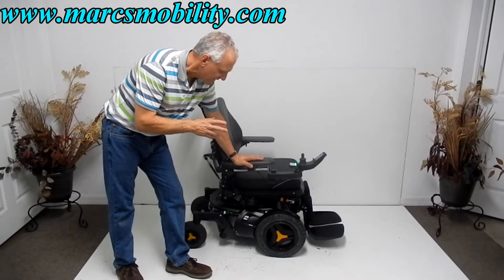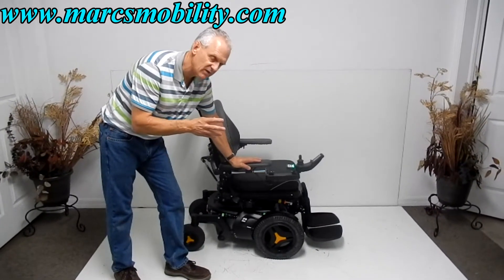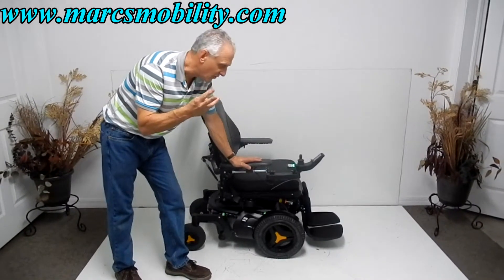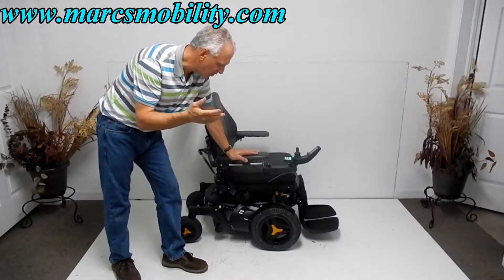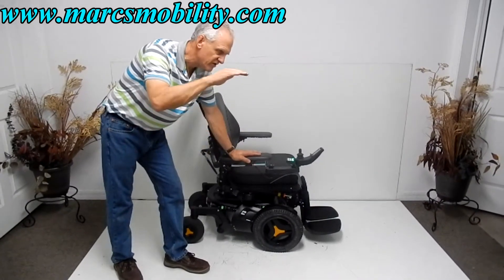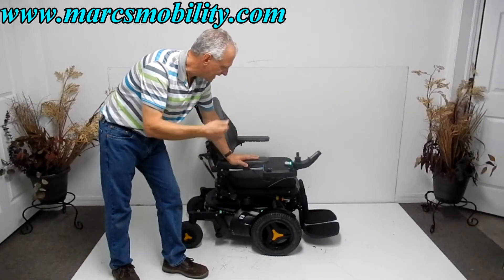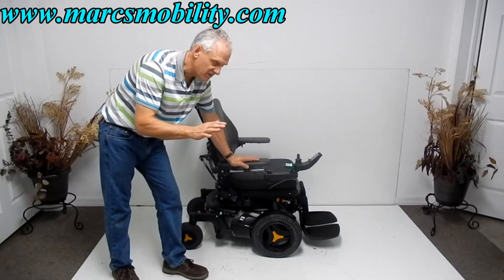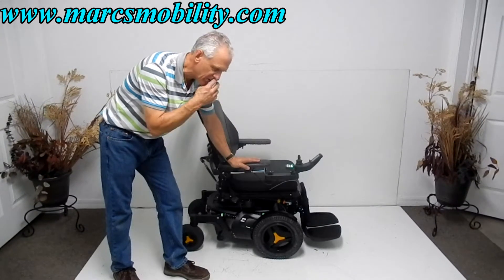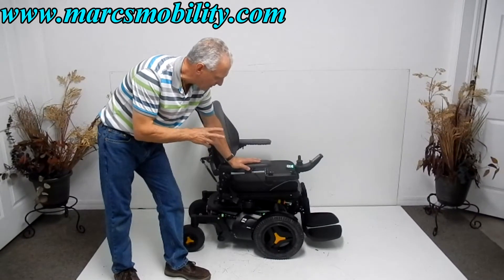This power chair is exactly one year old — July of 2016, so it's about a year old. It has three miles, so it's practically brand new. It's fully loaded. It has a 12-inch seat lift, the electric tilt, the electric recline, the electric legs — it has everything. It has a swing-away joystick. These are very popular right now because these are the top of the line.